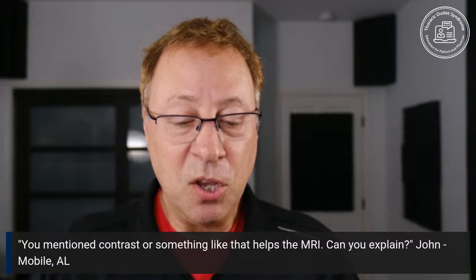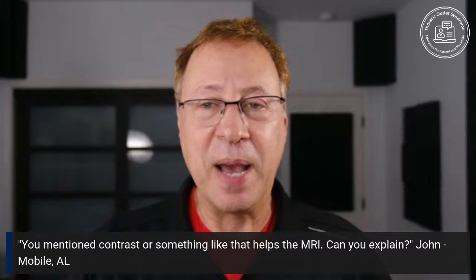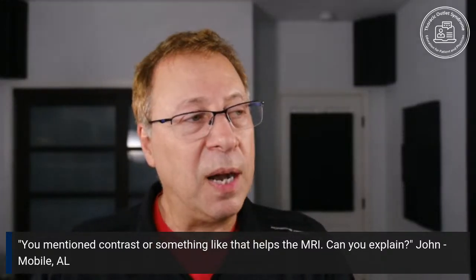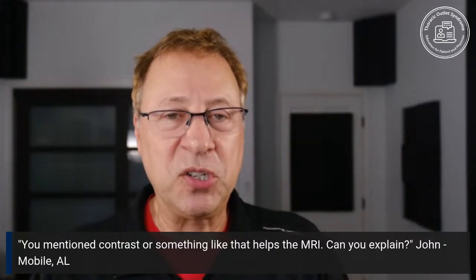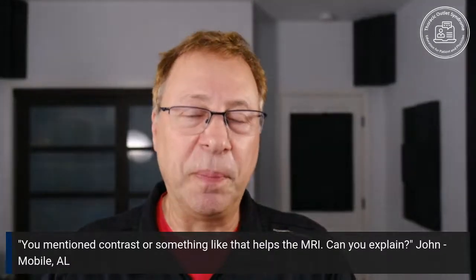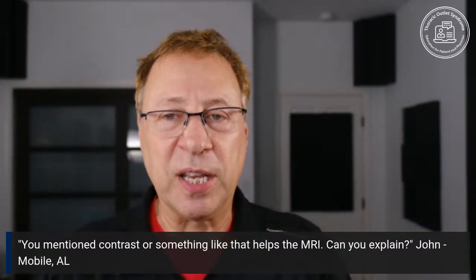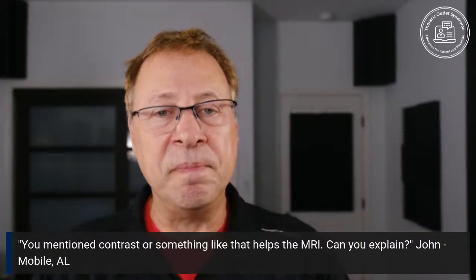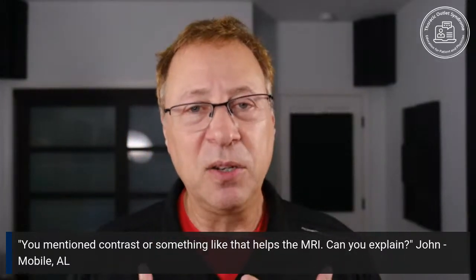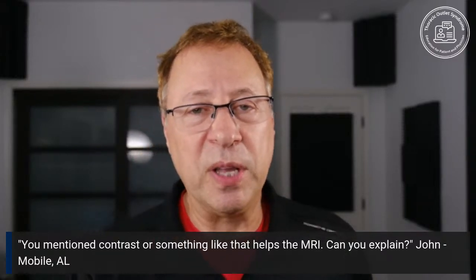All righty. You mentioned contrast or something like that helps the MRI. Can you explain? And that's John in Alabama. Thank you, John. So we give contrast on almost all of our MRIs. We do it for a number of technical reasons that help certain things stand out, but in particular, to get the MR angiogram pictures that you saw, those nice, beautiful pictures that show just the white arteries, we need the contrast to get the best quality images. And then we can also get pictures of the veins when that contrast flows through the arms and comes back towards the heart. So we can get angiograms and venograms. And I think that's the most important reason that we do give the contrast.